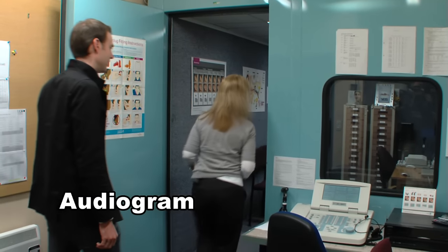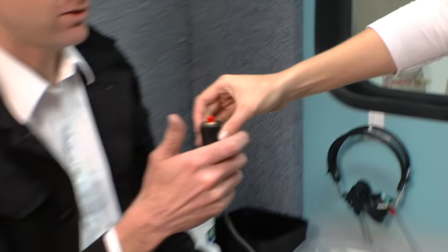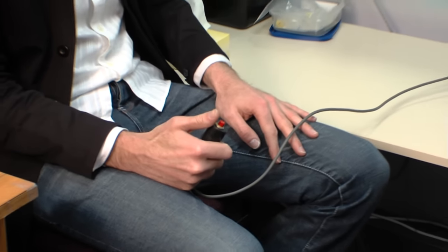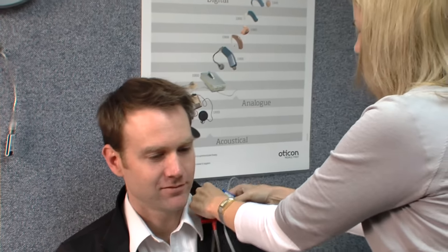Now for the audiogram. Just have a seat there. So I'll just give you that button there. What's going to happen is I'm going to put some headphones in your ears and you'll hear beeps in one ear at a time. So whenever you hear a beep, you're just going to press that red button, even if it's very soft. I'm just going to put these in your ears — these clip onto your jacket.